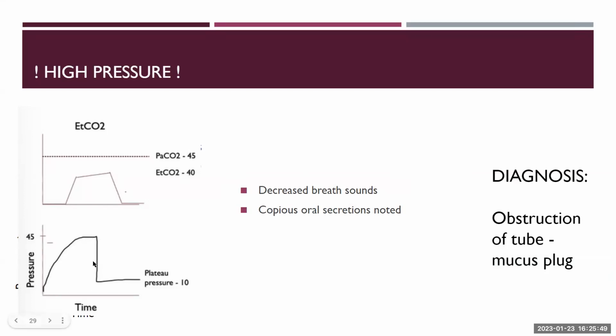Remember, the peak pressure minus the plateau pressure is the airway resistance, and that is huge. And for the CO2, this is a bigger gap than usual, so there are issues with the CO2 coming out also. Does that make sense? This picture: a physiologic end-tidal usually has a plateau. It doesn't keep building up. You have an ascending arm and a descending arm, with a plateau in the middle. The fact that this keeps building up tells me that there is an airway resistance problem.